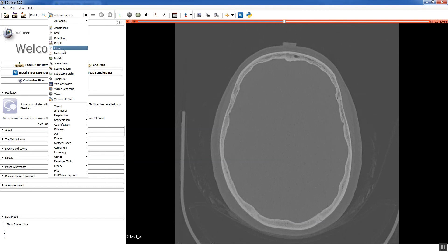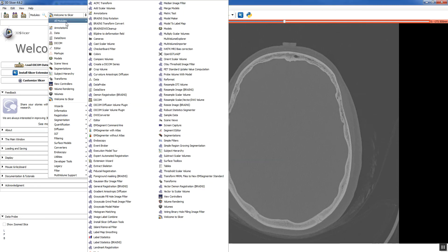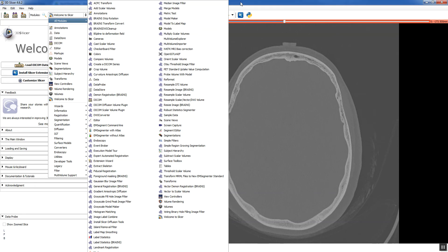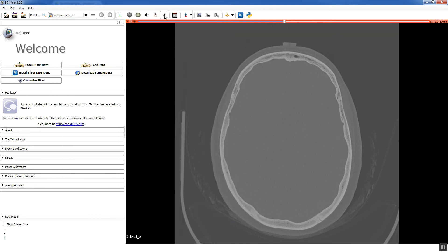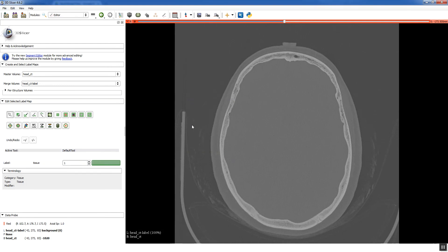And for any given module in Slicer, there are numerous ways to access it. The editor module you can get to from a button here. There's also this menu here that has a surprising amount of content. So these are commonly used modules. The editor is one of those. Then they group them by tasks. So under segmentation you have the editor. And then they just have a list of all the modules. So the editor is also accessible there. So we can just access it with the big button.